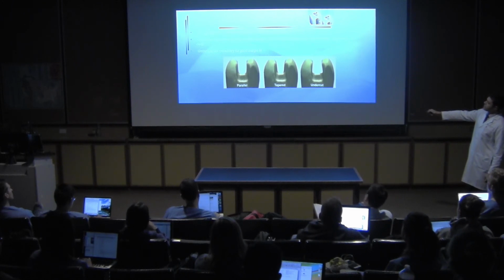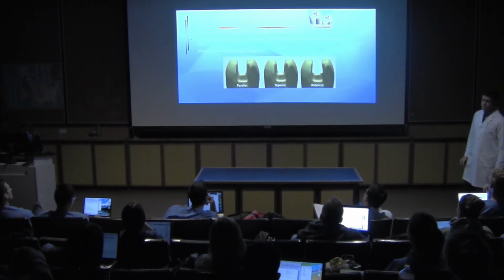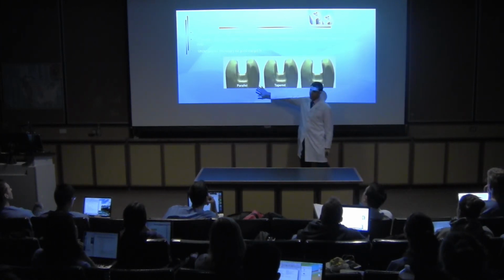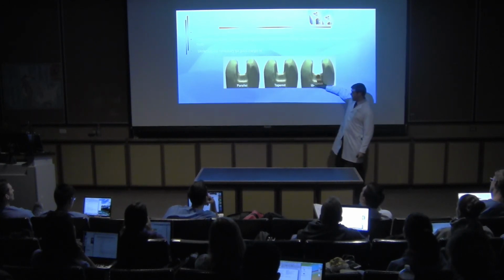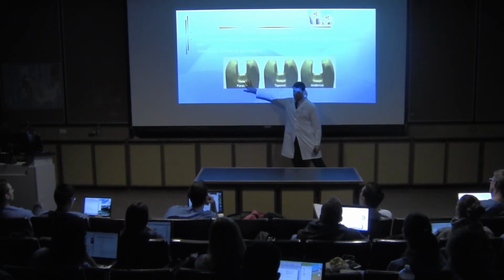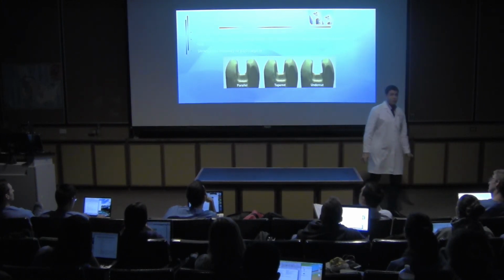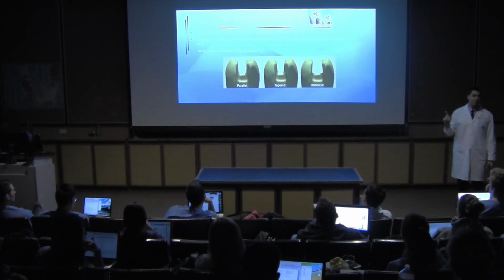6 to 8 degrees wall taper is optimum for internal adaptation and margin fit. Always tapered walls. Never undercut or parallel. The restoration will not fit here and here. It's impossible. You will have a hard time trying to fit the restoration on this type of walls.